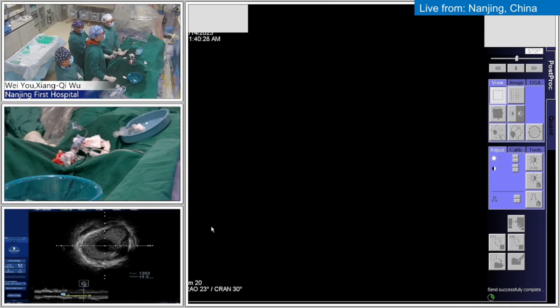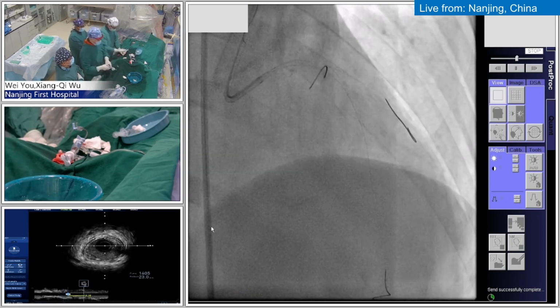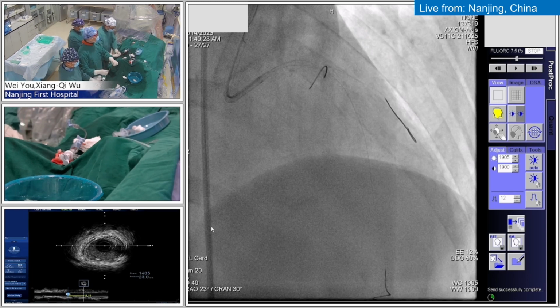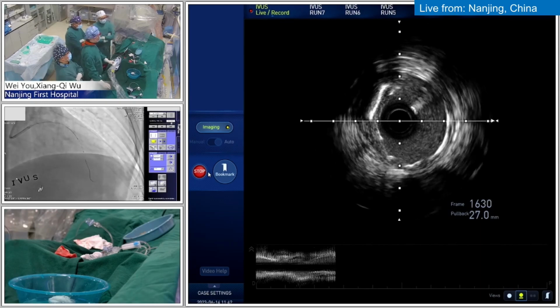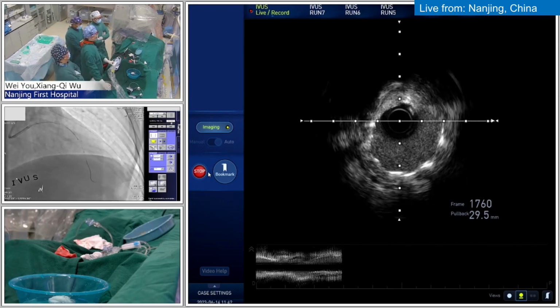The lack of calcification in a bifurcation lesion is, I think, the single biggest factor which makes it easier to expand the stent and have better long-term outcomes. So far, things are looking good, with the stent expansion there. I think that coverage was pretty good.